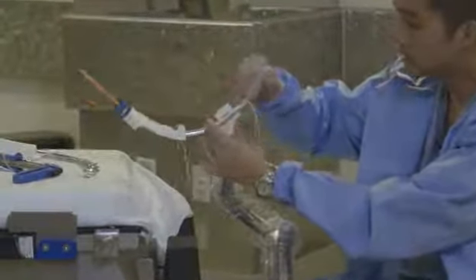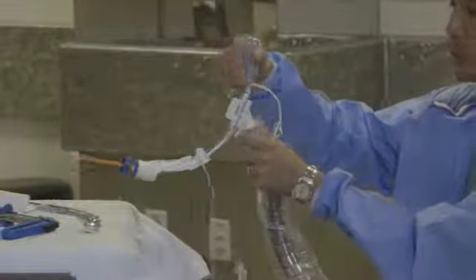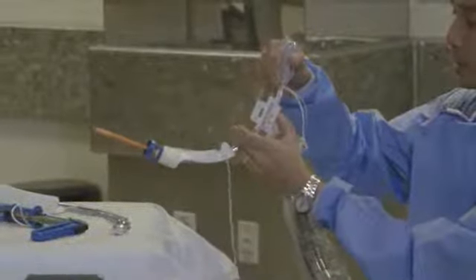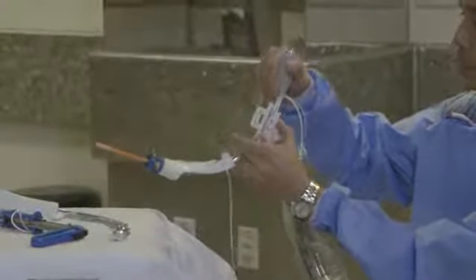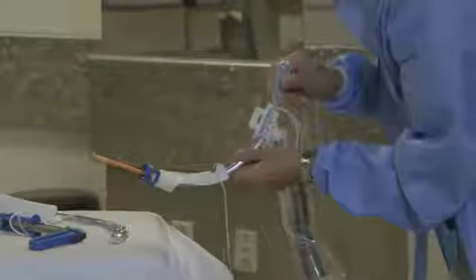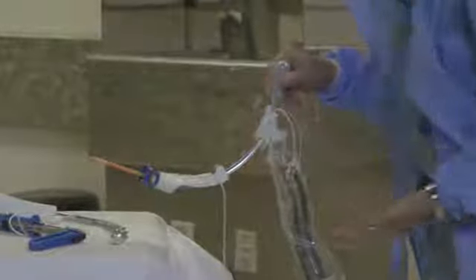You're going to feel it. Now this is technically going to be in a patient, right? So I'm going to go ahead and show you what this would mock up. But let's say this is positioned this way in the patient. You're actually going to feel this thing. There's a groove that you're going to feel this thing sit in, right, as you mount this. And when that sits in the appropriate location, you'll know, because there's a feel to it. And then you're going to be able to lock it into place like that, right?